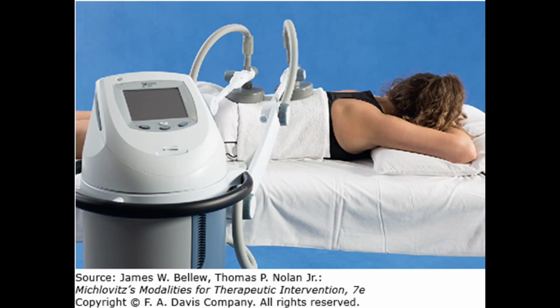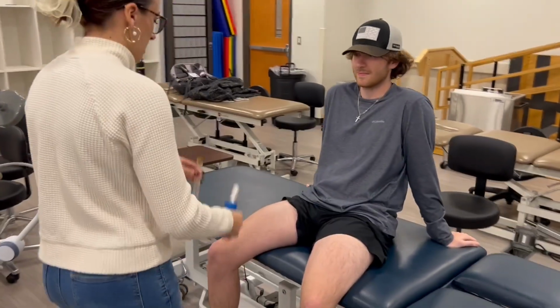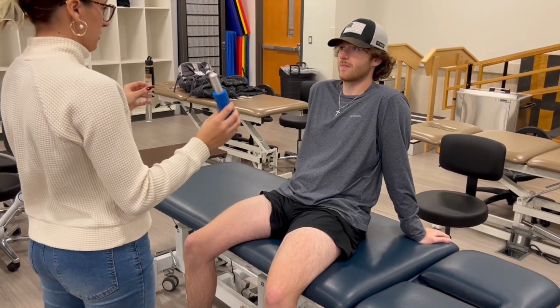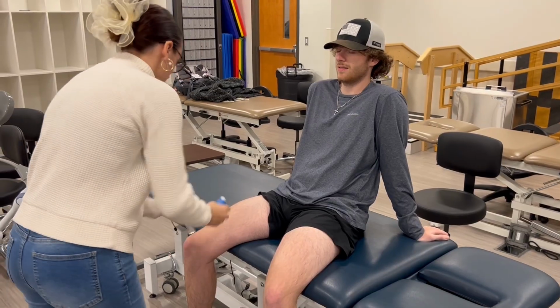This is a video highlighting the therapeutic effects of short-wave diathermy. Here we have a student physical therapist performing a skin check and a sensation test. We're using the hot-cold sensation test because the short-wave diathermy is a therapeutic heat modality.